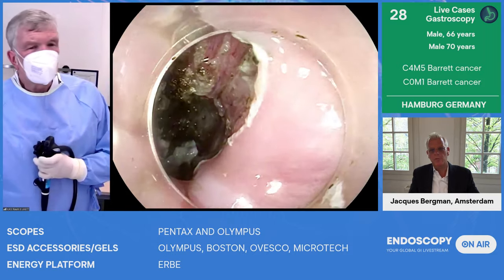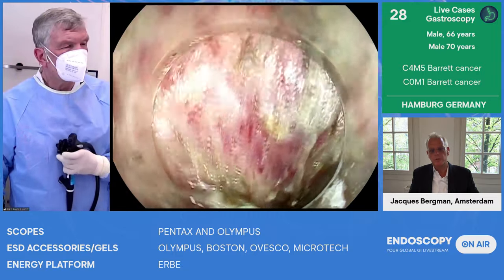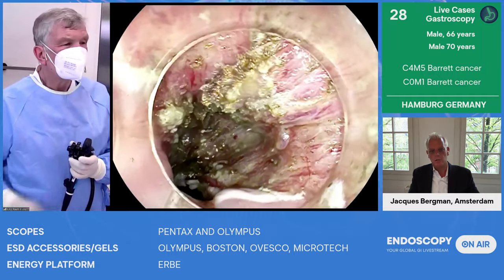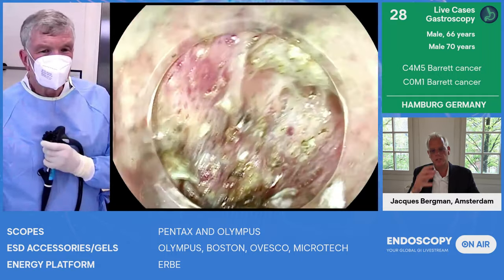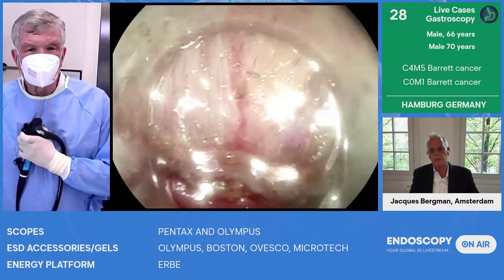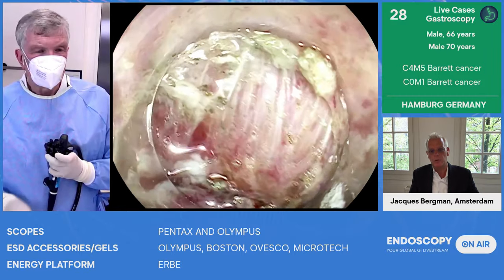Well, maybe I can make a couple of comments just to keep talking while we wait until we move. Feel free to switch rooms. One of the key things is, if you make your mucosal incision, you need to make sure that it's deep enough, because if the mucosal incision at the anal side is not deep enough, you will continue your submucosal dissection underneath your previous incision. So it's not only doing the incision, but you need to extend the incision until you're really at the submucosal plane.